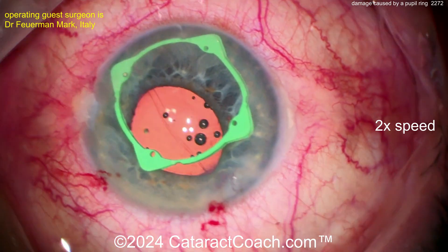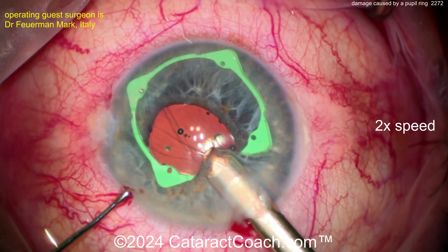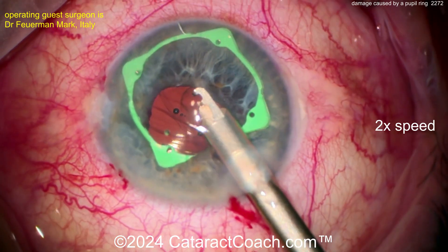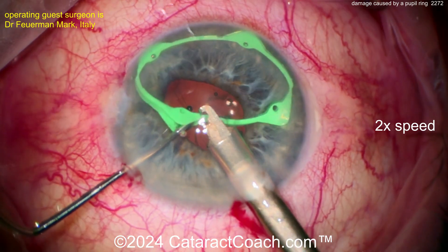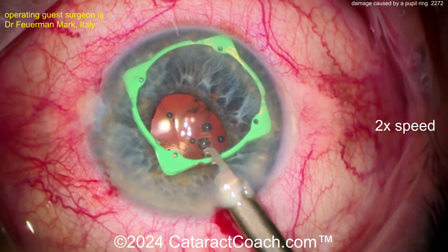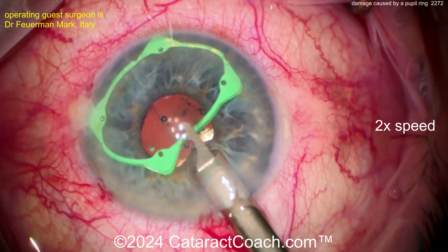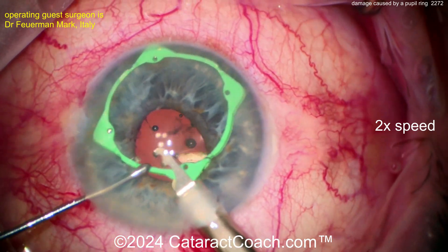Now let's take this thing out of the eye. Here's where the issue becomes apparent. You already have a little bit of a prolapsing or weak iris there, a little bit of shallowing of the anterior chamber. So maybe more viscoelastic would be helpful here. Grab here — get the hook out and grab it anywhere there. You've seen me do this with a Malyugin-type ring, and it'll work with this one also. When you grab this nice and easy — this is a single-use device, so it's okay if we damage it, we're getting rid of it. Grabbing onto it, almost, almost. Once we grab onto it, we can retract it into the injector and remove it from the eye.